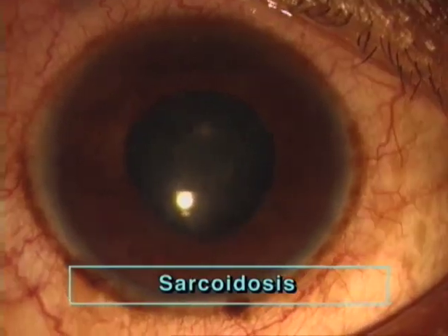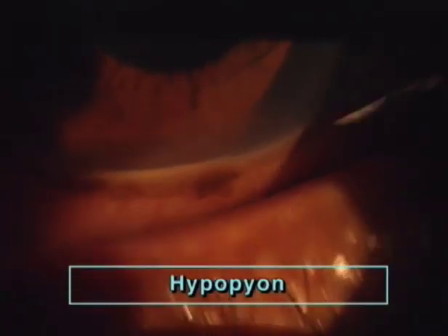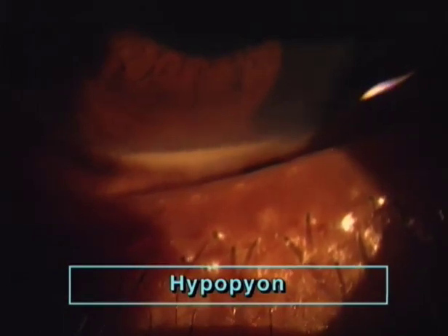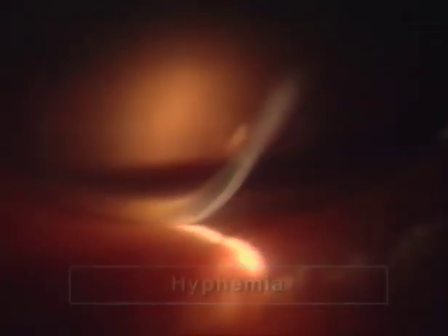Another example is this case of sarcoidosis, where a barely visible hypopyon appears in its full extent by the tear film prism. And in this next case of blunt trauma, the tear prism reveals otherwise invisible hyphemia.